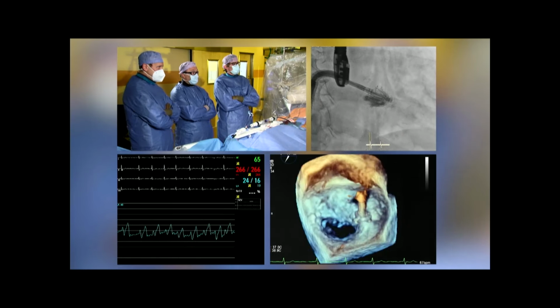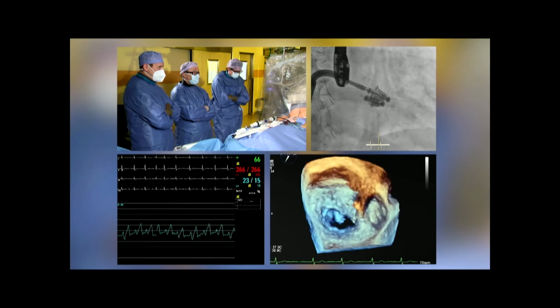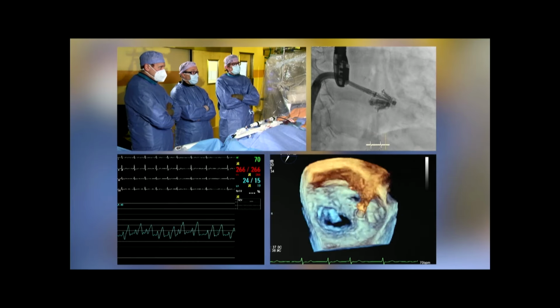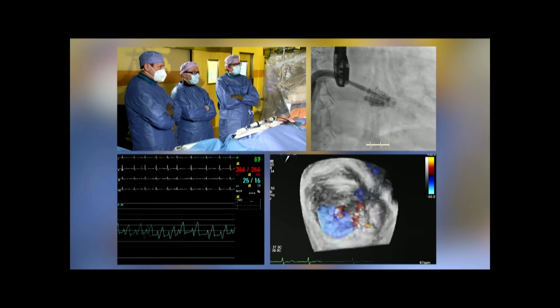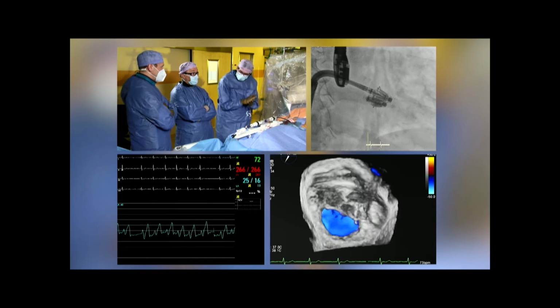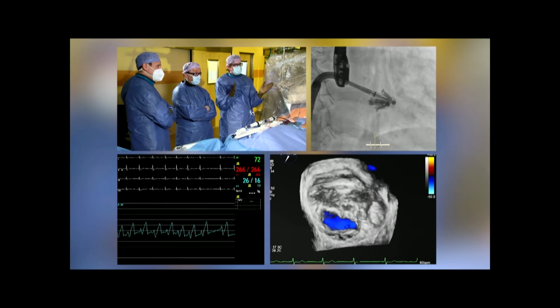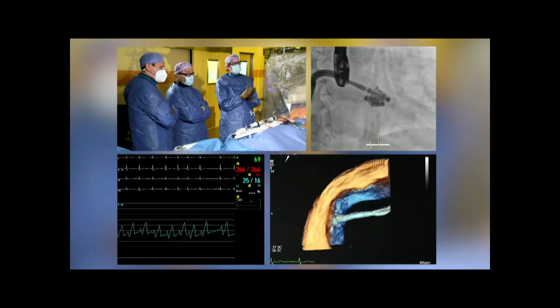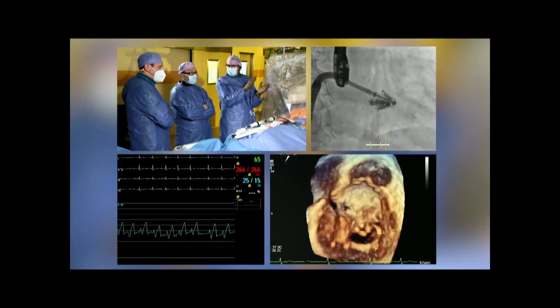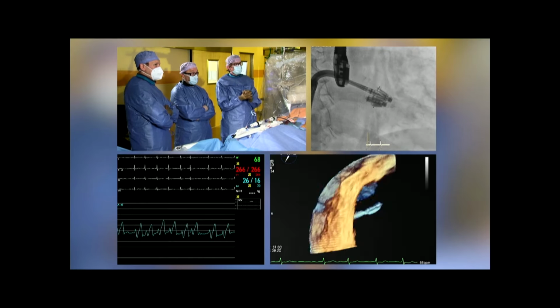You see nicely the tissue bridge, all the leaflets are well in the device. And I think it would be very nice if you can now add the color flow to this view, because we saw it before and now it's significantly better. That's all. MR assessment is important because we treat MR. But stability and longevity of the result, therefore, I believe it's also very important to assess anatomy and the overall appearance of our therapy and intervention.